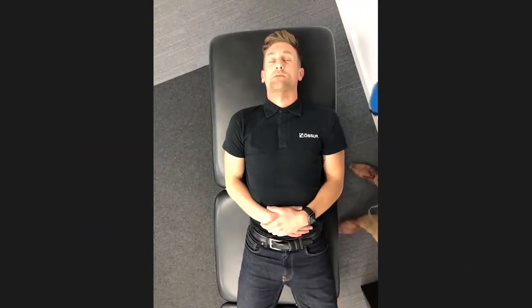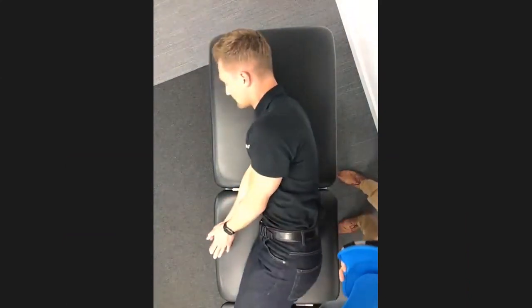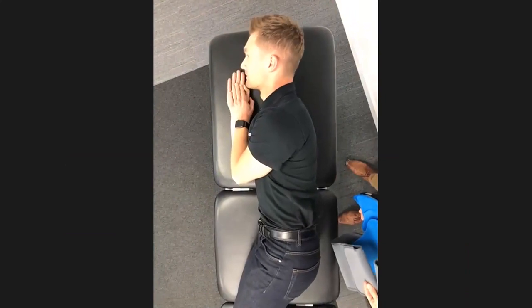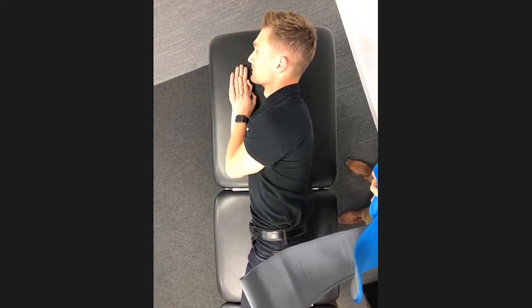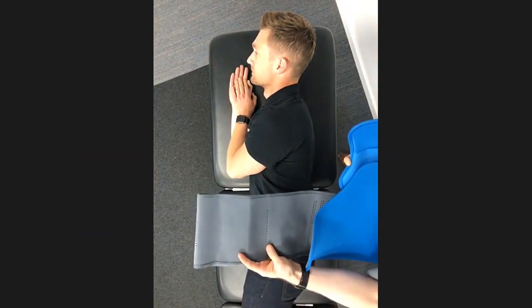I hasten to add in this, we're not going to utilize correct spinal protocol. The couch isn't wide enough in order to do this. And also it's important that you follow the protocol in your individual hospital. Okay, so this is exactly as it comes out of the kit. You would log roll the patient according to correct protocol. And what we're doing is just passing this section of the belt underneath the patient.